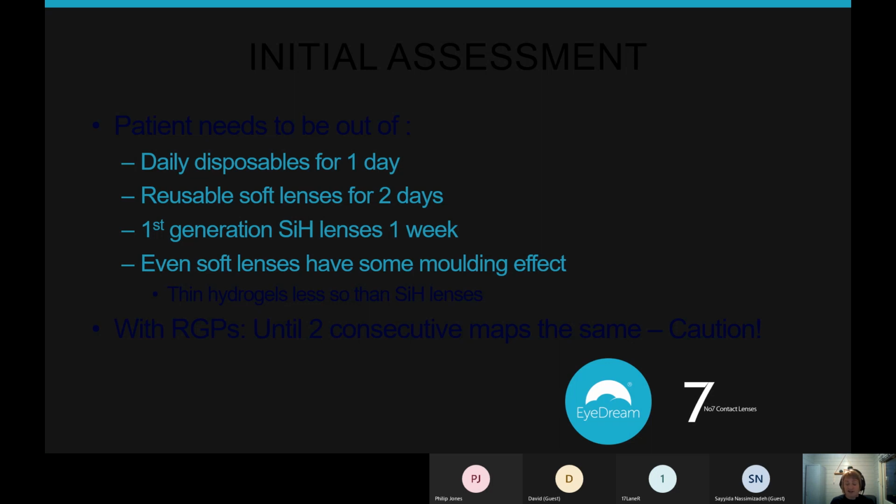Because she'd been in hard lenses for long enough that the lenses were fitted as best they could be, but the cornea had to have an element of fitting to the lenses. And so she was needing to go into a toric lens, which would have cost her more, but which at that point I absolutely could not charge her for. And the worst bit of this story is that she lived about 4 doors down from my house. So I used to see her on days off when I was getting the shopping out of the car. She'd come up and say, oh, my left eye seems a bit worse today. And I'd have to repeatedly say, why don't you make an appointment and come into the practice?